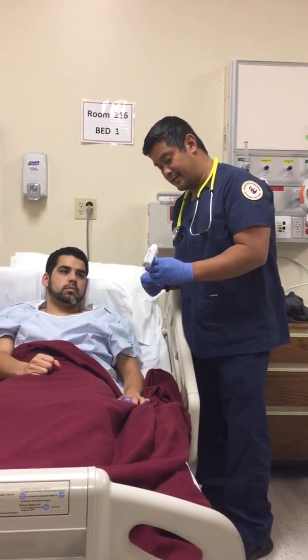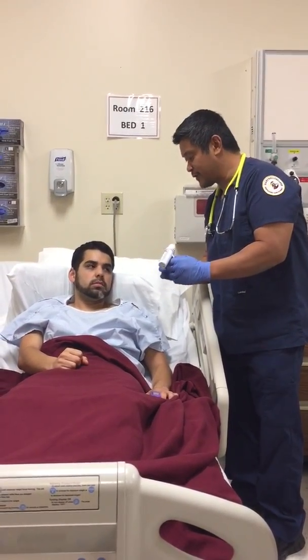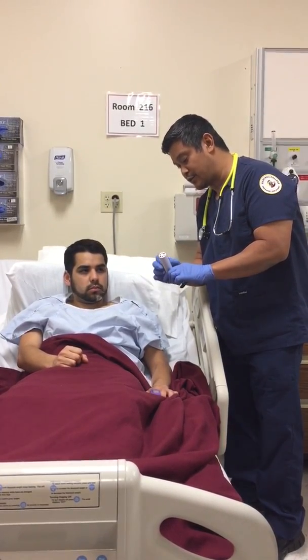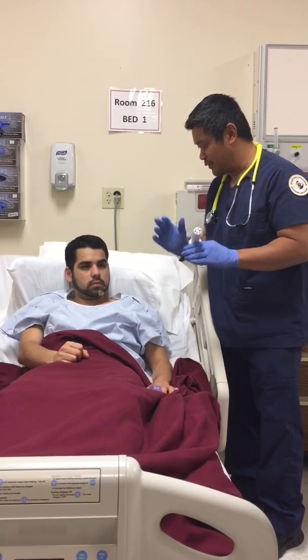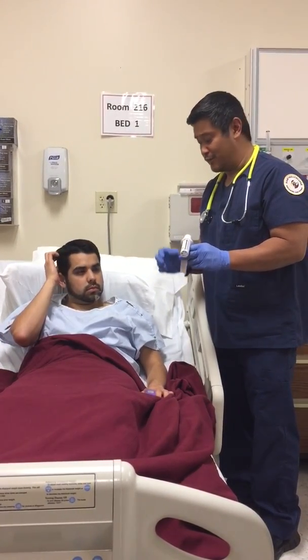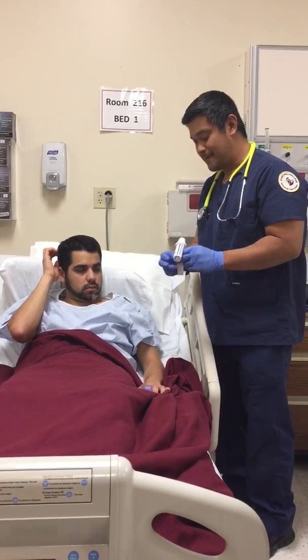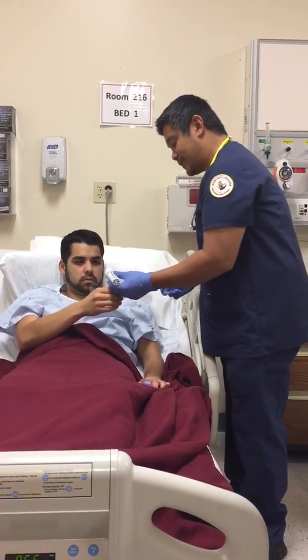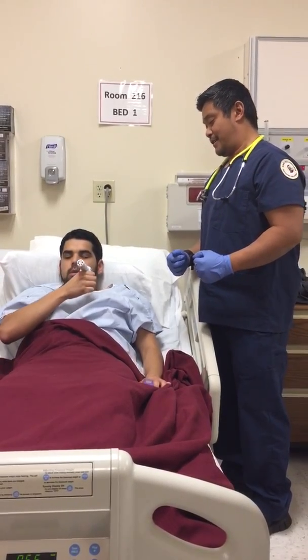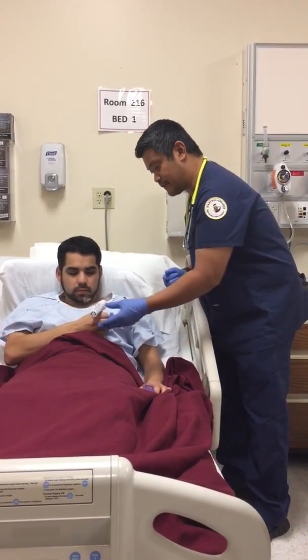And the idea is you would just wrap your lips around this right over here and just blow as hard as you can and try to get this meter as close to your goal as you can, okay? And we're going to do this 3 times, and we'll record your best results, okay? So go ahead and do this for me. Take a deep breath in and blow as hard as you can. All right, good job.